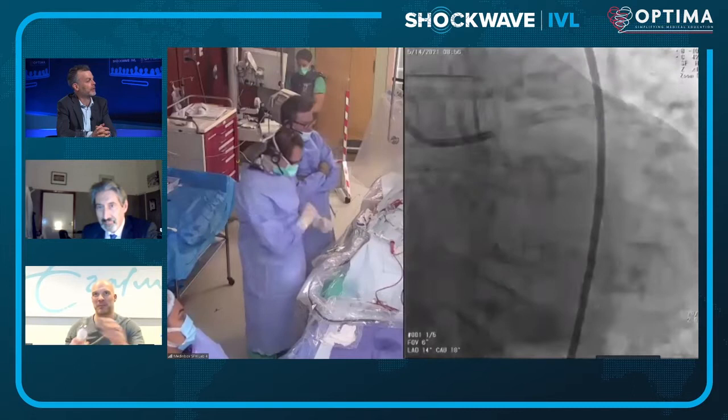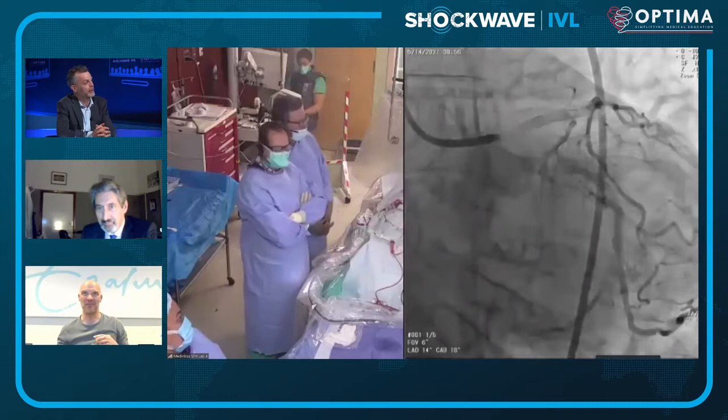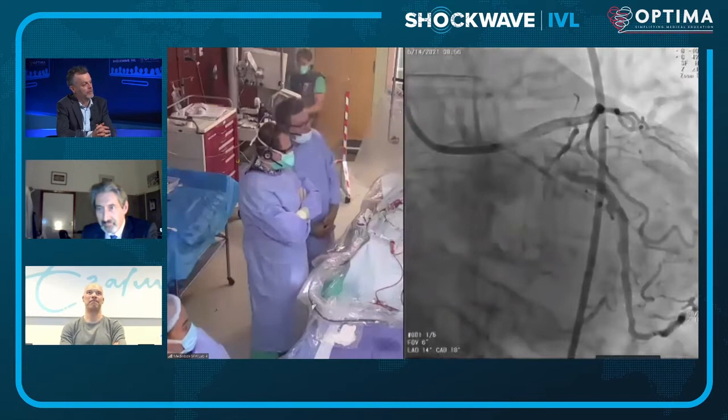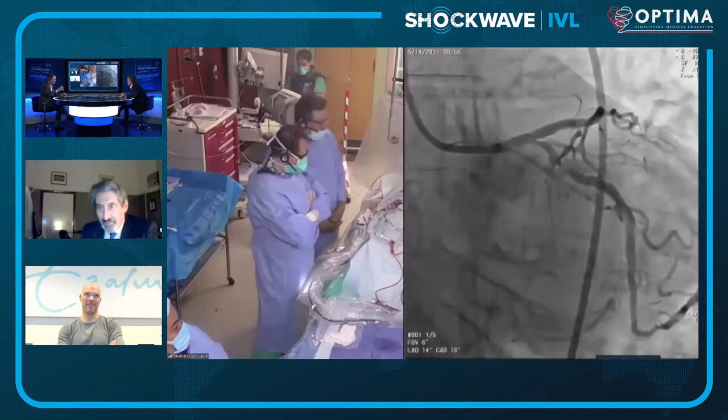Alan explains the value of a resting index pullback: it tells you which lesion has the biggest gradient and gives the biggest bang for your buck. Using SyncVision co-registration with the angiogram, it becomes clear that the majority of the gradient is at the osteal circumflex — maybe a little in the left main — and it allows measurement of how long a stent is needed, in this case around 33-34 mm.